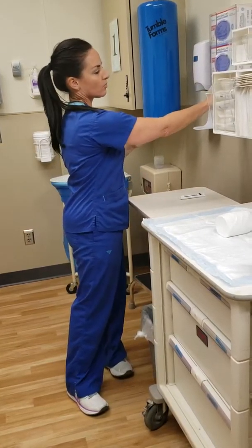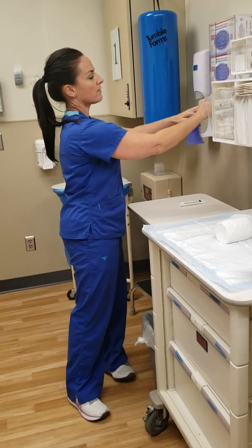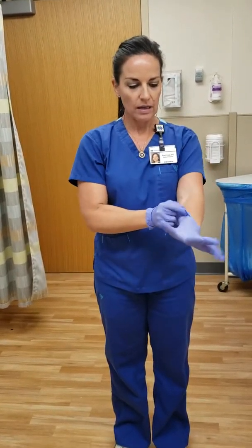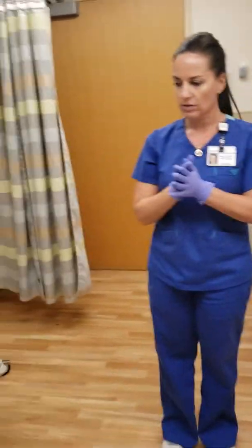Always do hand sanitizer before your hands go into a box of gloves — keep all the gloves minimally contaminated. Now that I'm gloved, I'm going to only touch this field or my patient, one or the other.